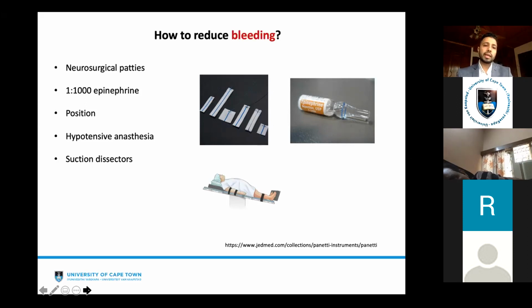They also advocate hypotensive anesthesia, and especially when we're beginning the use of suction dissectors. And the endoscopic ear surgery set that has been widely marketed and is used in many parts that use this technique is the Panetti instrument set, where most of the instruments have suction that is able to attach to these instruments.